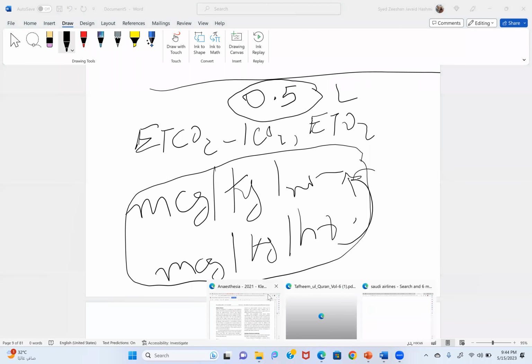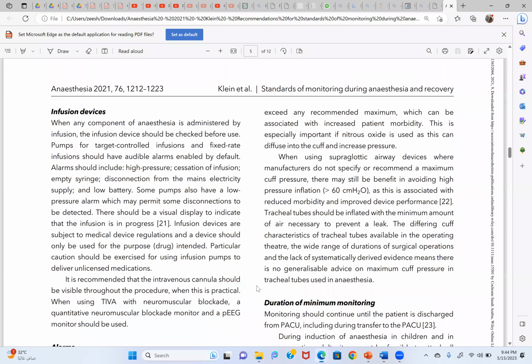Okay. I have seen old consultants who used to twist my neck for changing the number, because in cardiac surgeries or in many surgeries there are a number of infusions: epinephrine, norepinephrine, muscle relaxant, and TIVA, and so on, so they are messy.